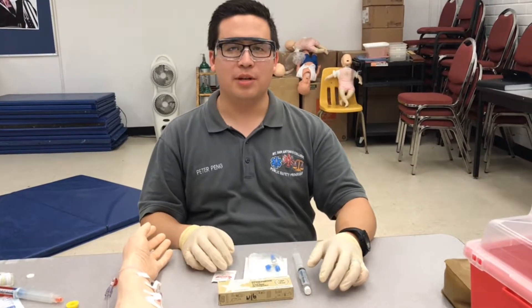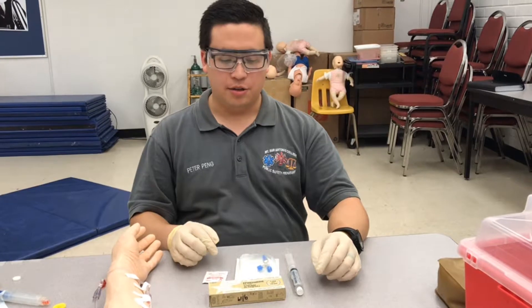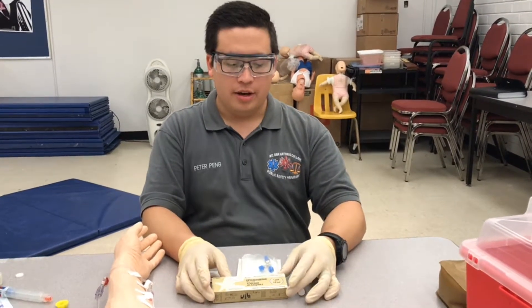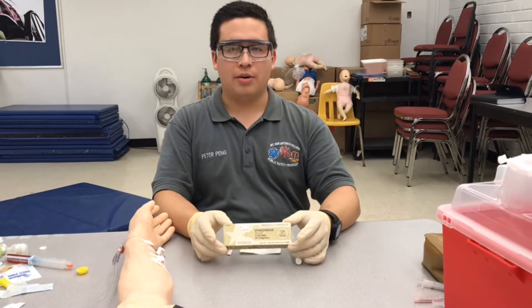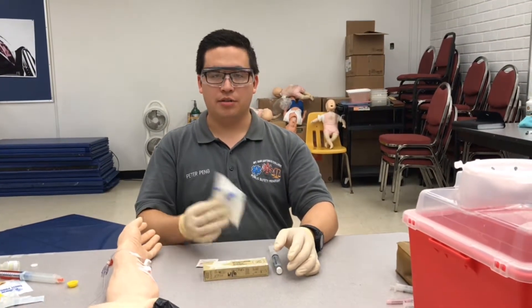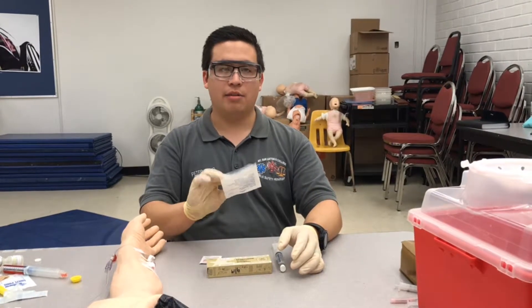I'm going to demonstrate how to administer push-dose epi. Push-dose epi is typically used for non-traumatic hypotension. First we're going to start by diluting our pre-load of epinephrine, and then I'll show you how to administer it using a three-way stopcock.